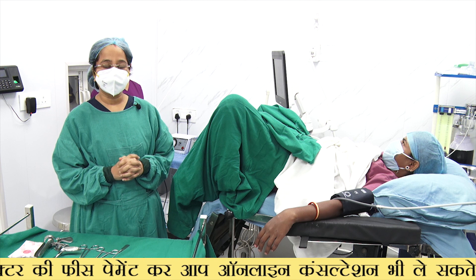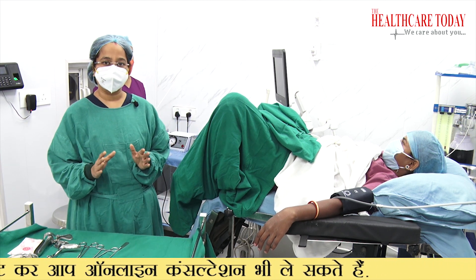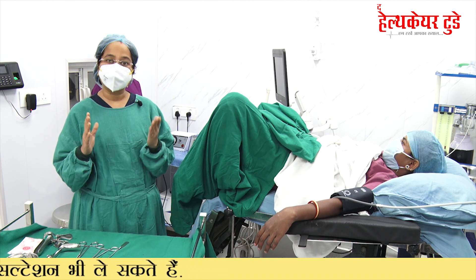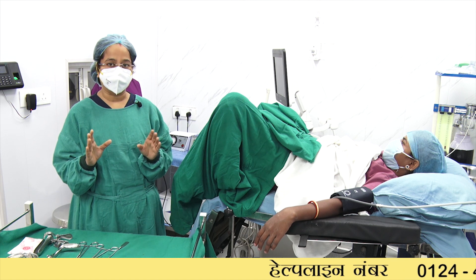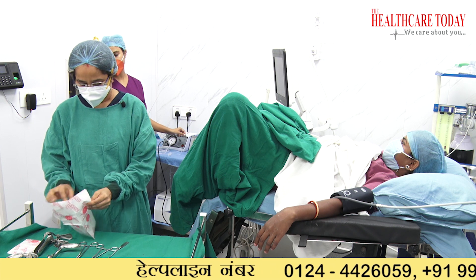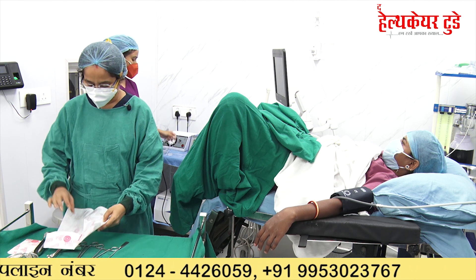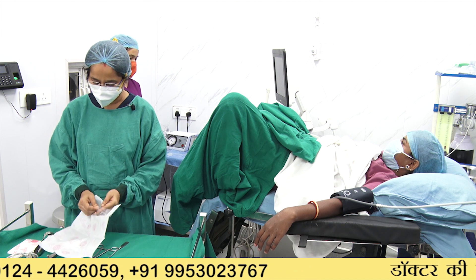This procedure is usually done under short general anesthesia. Everything has to be sterile — I am using a sterile gown and have washed my hands as we do for a surgical procedure. It is a small procedure but you have to take all precautions to make it sterile. The gloves have to be powder-free gloves; you have to be very particular about what kind of gloves you are using. You can use either paper gloves or powder-free plastic gloves, whichever you are comfortable with.